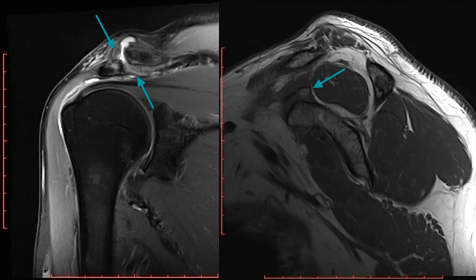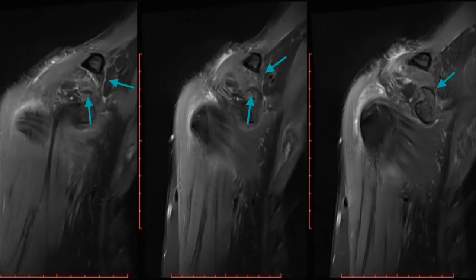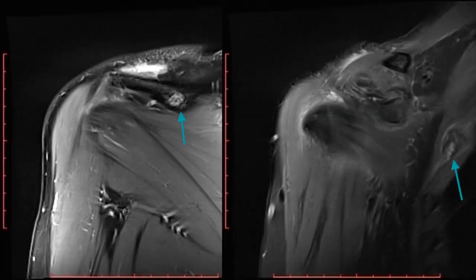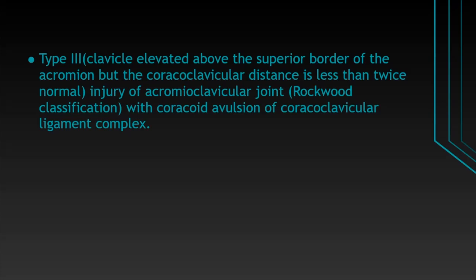The sagittal T1 image shows bone fragments at the anterior superior aspects of the coracoid process, and the normal coracoclavicular ligament complex is not visualized. Coronal PD fat sat images show a complete tear of the clavicular attachment of the trapezoid ligament; the remaining visualized ligament appears lax. Interstitial tears of the conoid ligament are seen. These findings are consistent with coracoid avulsion of the coracoclavicular ligament complex. Interstitial tears of the trapezius and deltoid muscles are also seen. An incidental well-defined lesion is seen in the spine of the scapula with punctate hypointensities, likely representing a chondroid lesion, possibly an enchondroma. Fracture of the right third rib is also seen. To summarize, there is a type 3 injury of the acromioclavicular joint with coracoid avulsion of the coracoclavicular ligament complex.